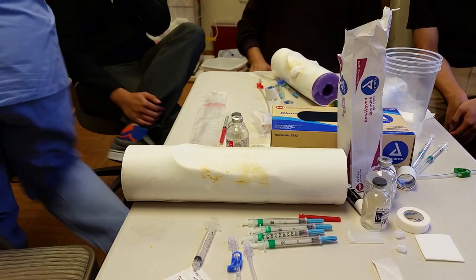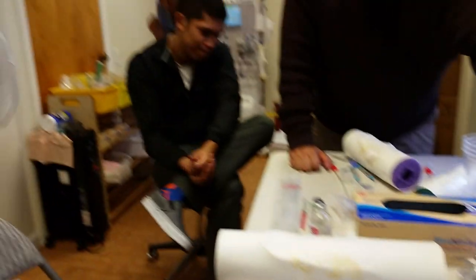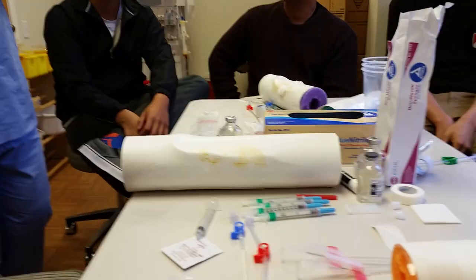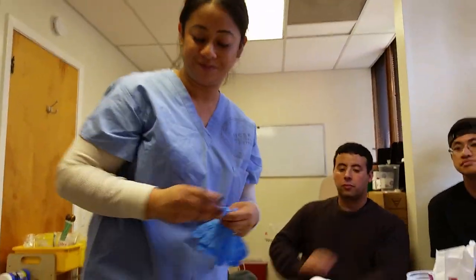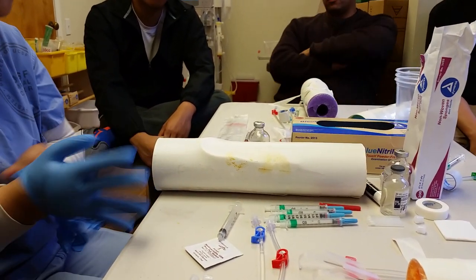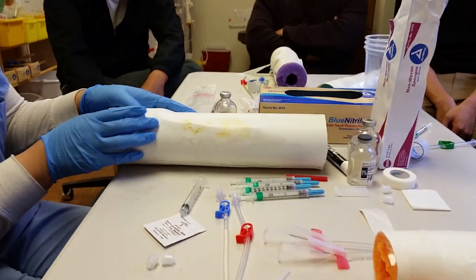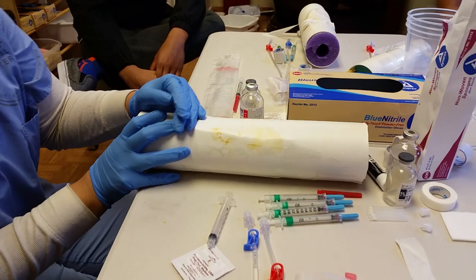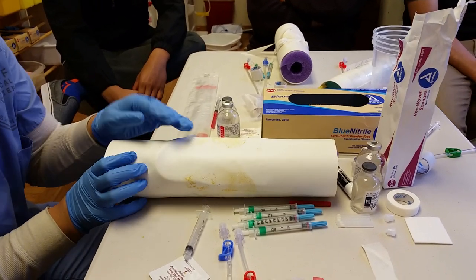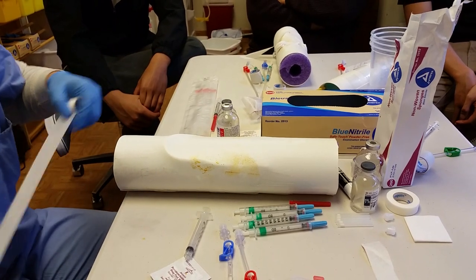From the beginning, let's say this patient has a graft. Say I'm going over here to wash my hands, right, and put two gloves on. Always verify before you do anything to a patient — you always verify that it's the right patient. You don't want to do the wrong thing for the wrong patient. So let's say, 'Hi Mr. Doe, how are you today?' Well, I'm just going to take a look at your access, monitor for any signs or symptoms of infection — redness, bruising, anything — any complaints from the patient. So let me tape this down.